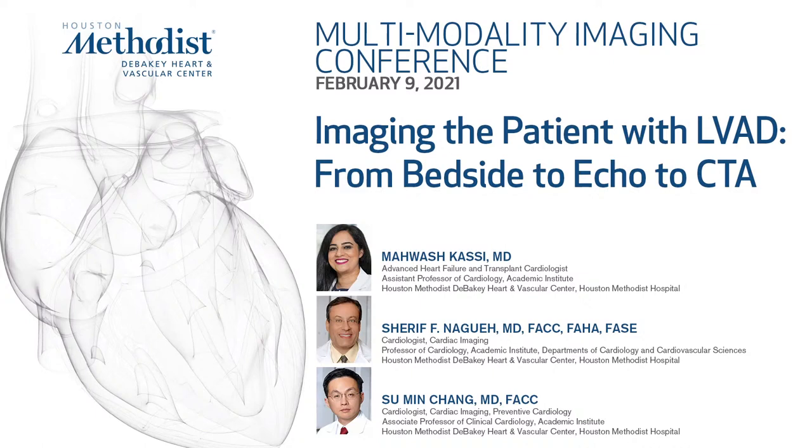So on that note, Dr. Chang, the next question, which I think you can answer probably, is what is your Nyquist limit setting for color Doppler in these LVAD patients? Well, for the new device, my understanding is the maximum velocity is usually less than one. Although it's a continuous flow and it does have some cyclic changes, a normal study usually I've seen is less than 1 meter per second.